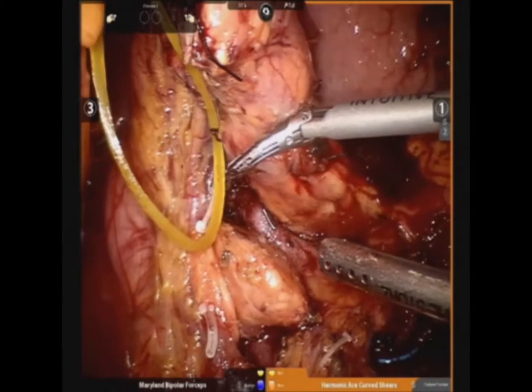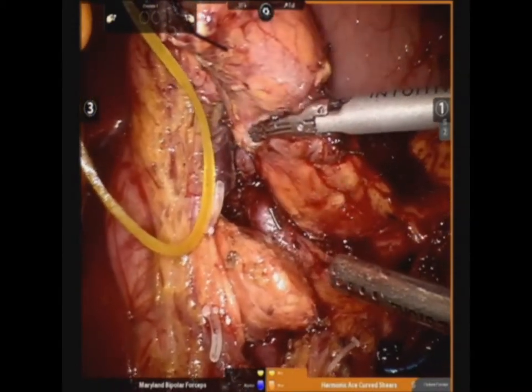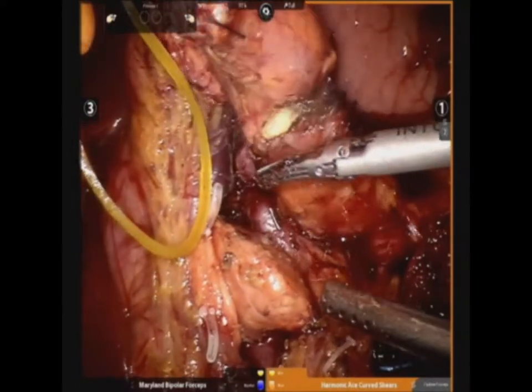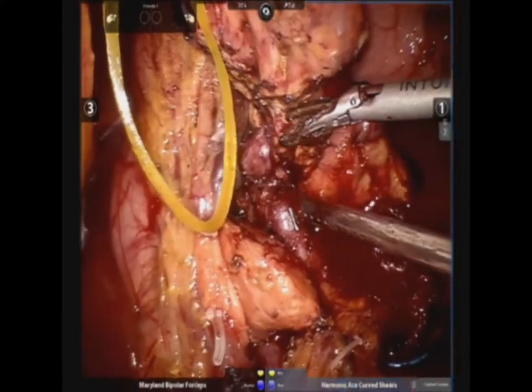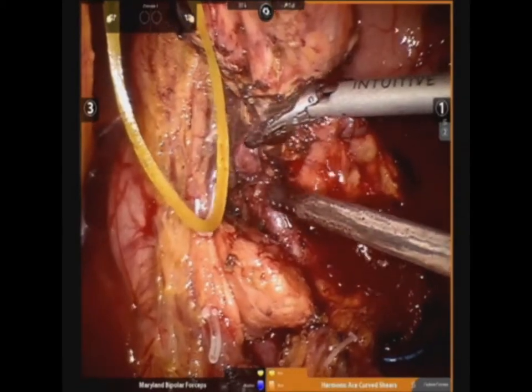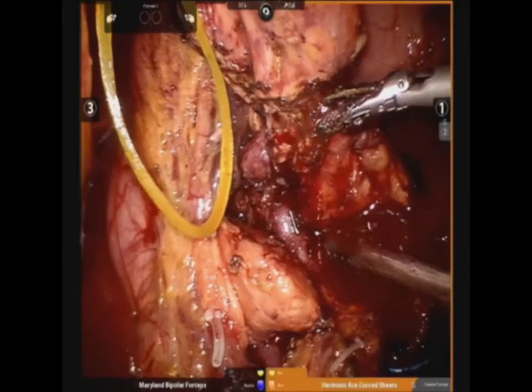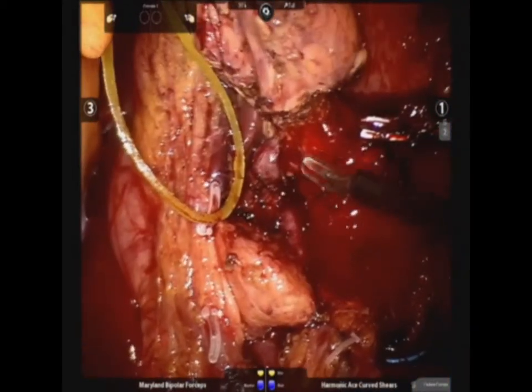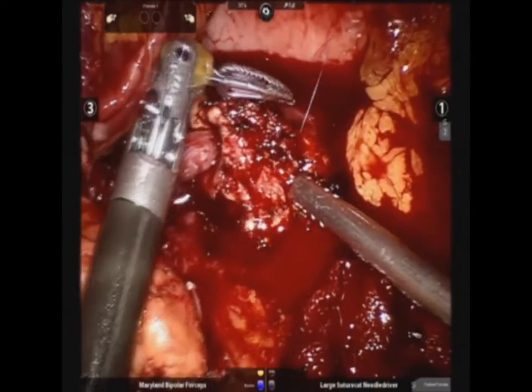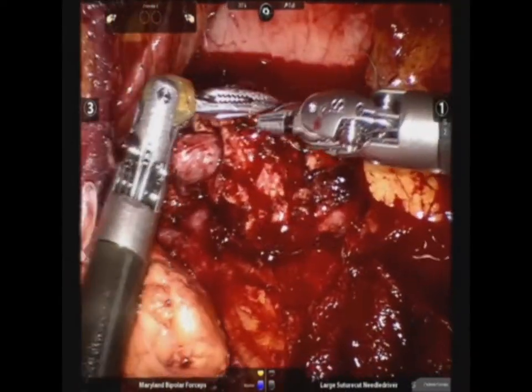The segment of pancreas, including the tumor, was resected using ultrasonic shears. Approaching the deep pancreatic parenchyma, the pancreatic tissue was resected using vibration of the active jaw to prevent coagulation of the pancreatic duct. After identification of the pancreatic duct, it was cut with laparoscopic scissors by the assistant surgeon. Small bleeders were controlled by suturing with Prolene 6-0.